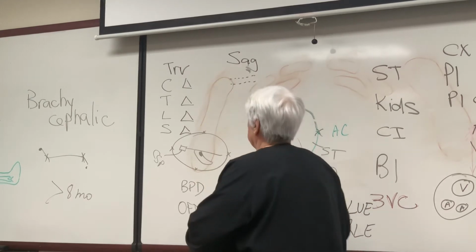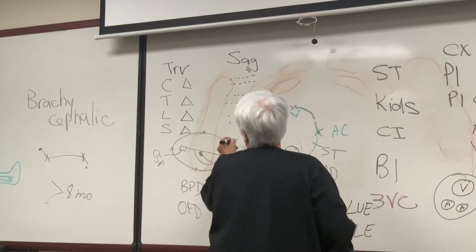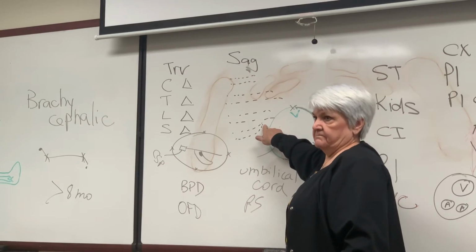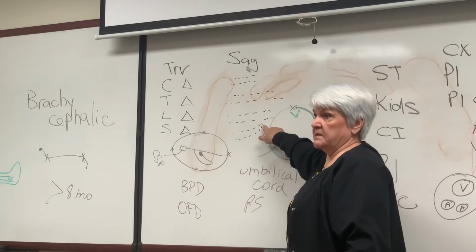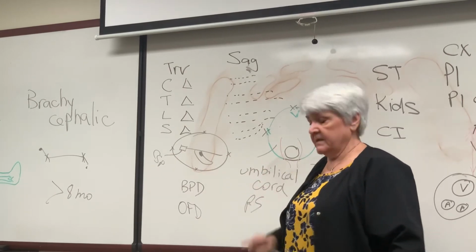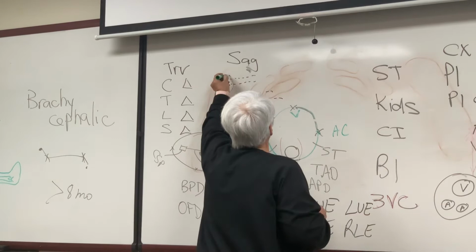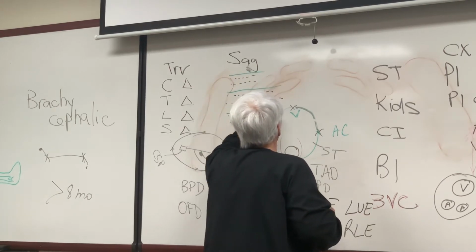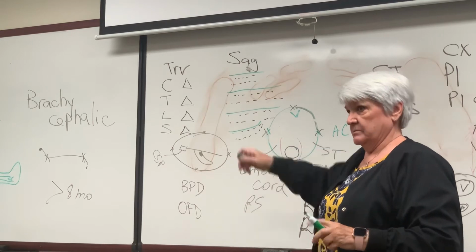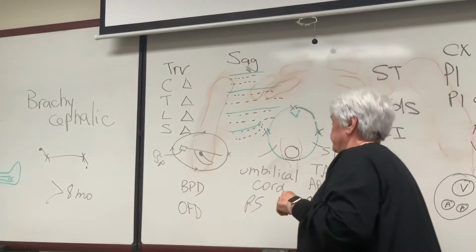Okay, so railroad tracks. T-spine. L-spine. 5 of those. S-spine. You have to make sure you have that nice little point. If you don't have this point, there's something wrong with the baby. Now, while we're also doing the spine, we're also looking at the skin level. Because there might be a myelomeningocele where the spinal cord is outside of the body. And then we're done.